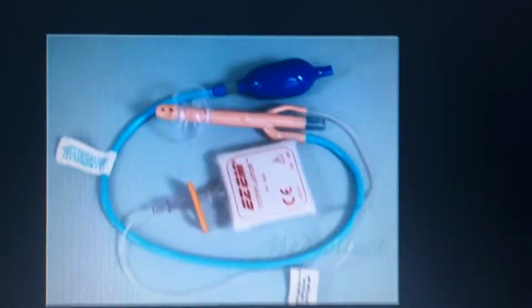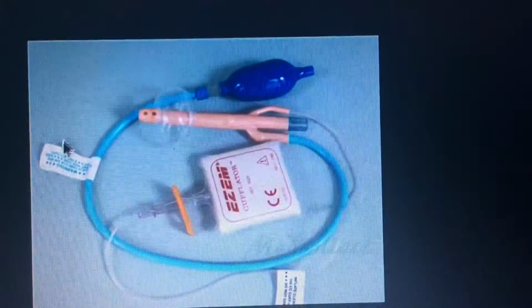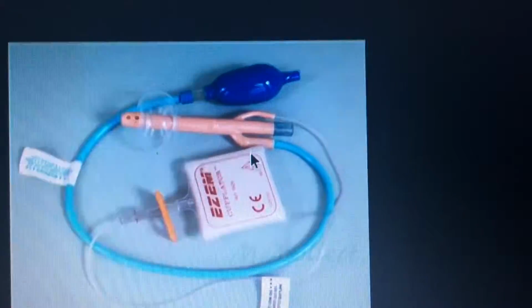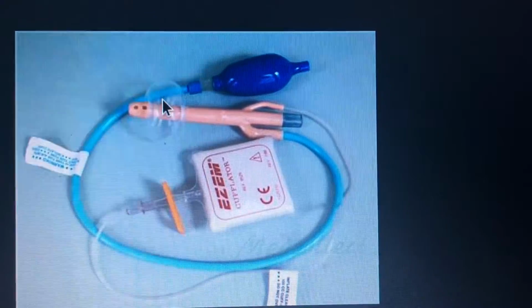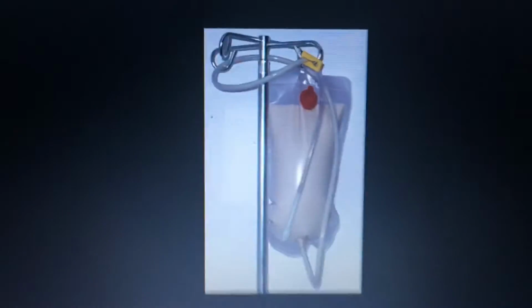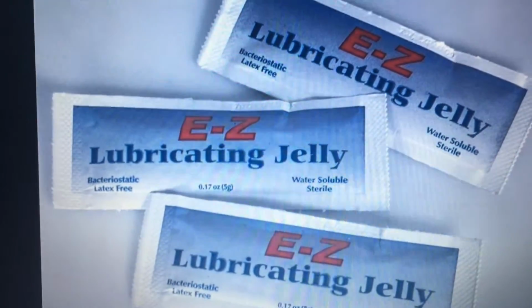So to go real quick over the supplies used in the barium enema. First, this would be the bulb to inflate the air through one of the lumen. This is a double lumen barium enema tip. This is used for 2 contrast. This other little hose goes to the cuff inflator, this little balloon thing. This here is the actual barium enema tip. This is the bag. It's hung 24 inches above the fluoro table, and that's barium in there. We fill it up to 1,000 mLs. And this is the lubricant jelly that we applied to the tip. We also have towels and gloves that we use.